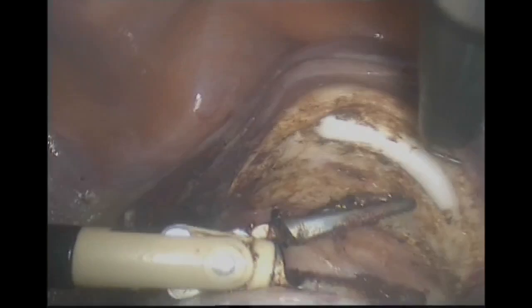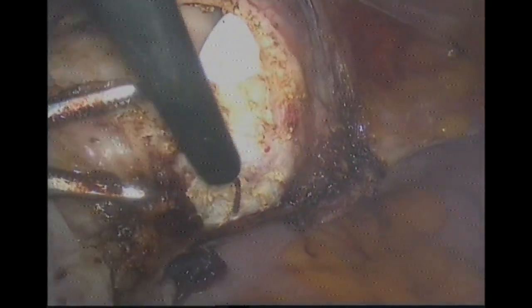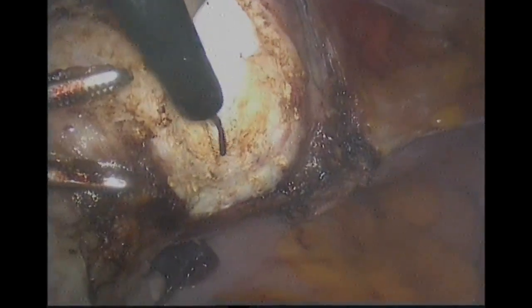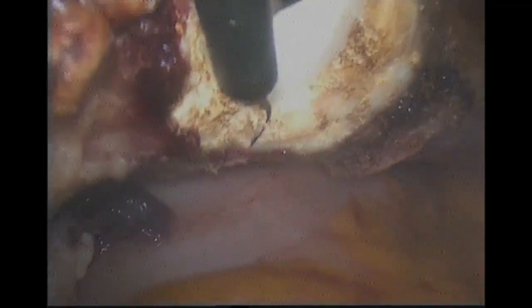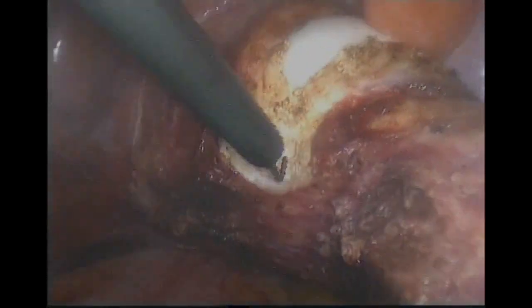the tip of the colpotomizer, not inside, not outside, to make the colpotomy very easy. Incise onto, not into, onto the tip of the cup rim circumferentially with the hook, as you see, with monopolar hook or spatula, low pure cut where possible. The cup maintains pneumoperitoneum and a bloodless plane.